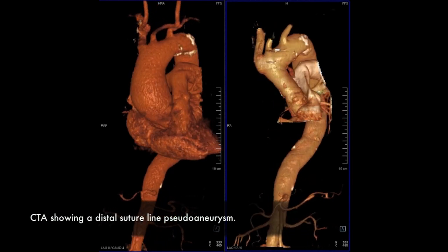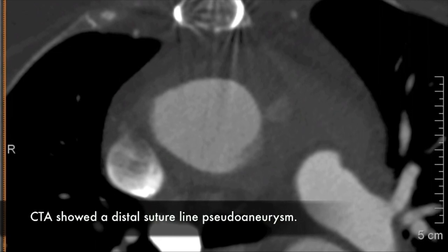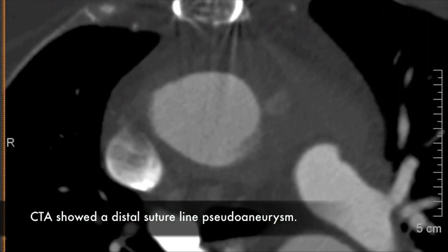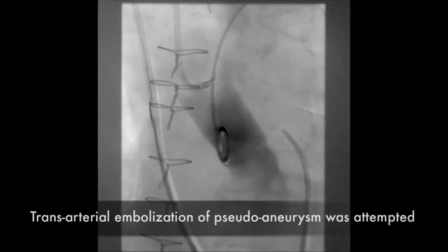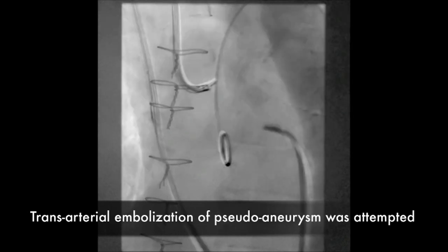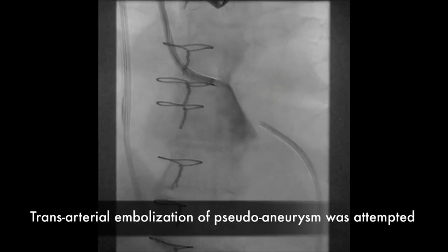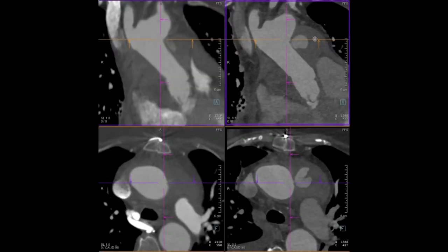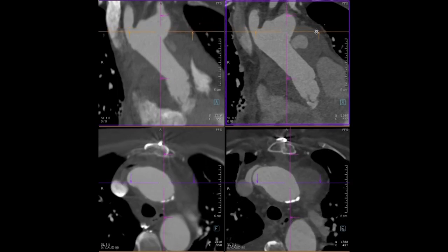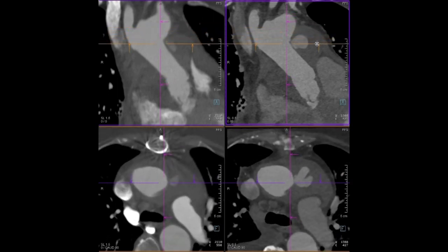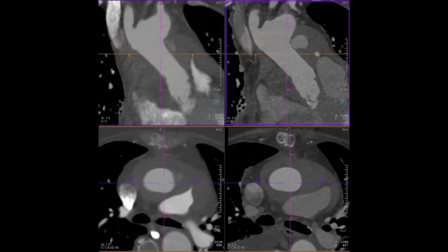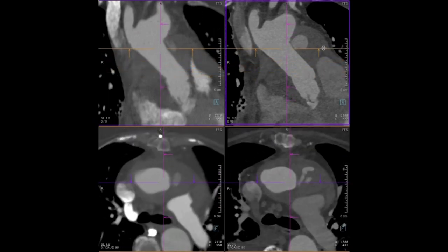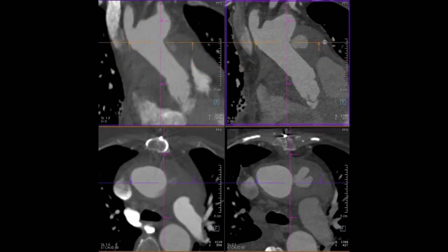The pseudoaneurysm had a very narrow neck measuring approximately a millimeter in diameter, as demonstrated on the axial sections. We thought the best approach would be through the upper extremity. The catheter was placed in the aortic root, but we could never get into it using a variety of different approaches. We observed her for three days, repeated the CT scan, and to our alarm it had gotten bigger with more hematoma around the pseudoaneurysm. So we felt definitive therapy would be required.